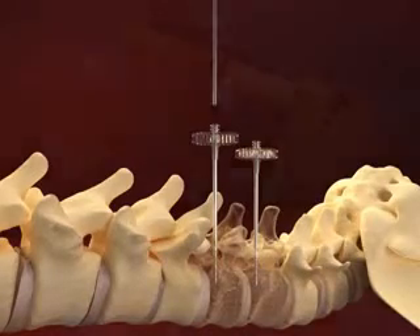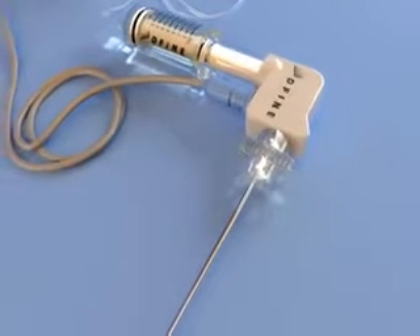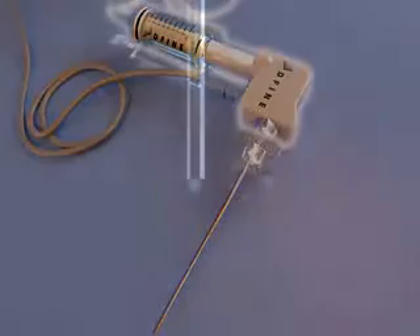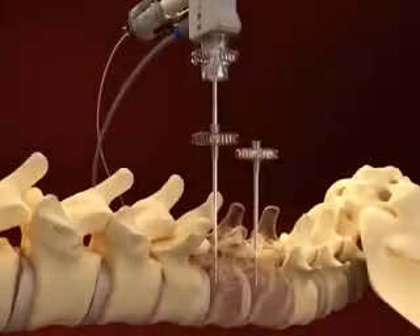The locking delivery cannula attached to an activation element is inserted into the vertebral body, and Stability ER bone cement is injected into the body. Prior to insertion, ensure that any excess cement is removed from the distal tip of the delivery cannula.